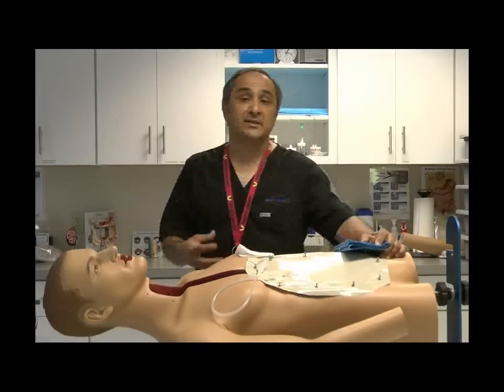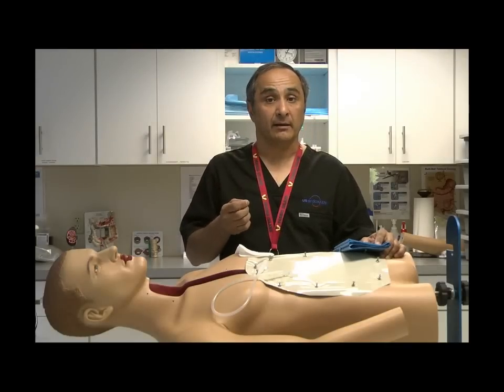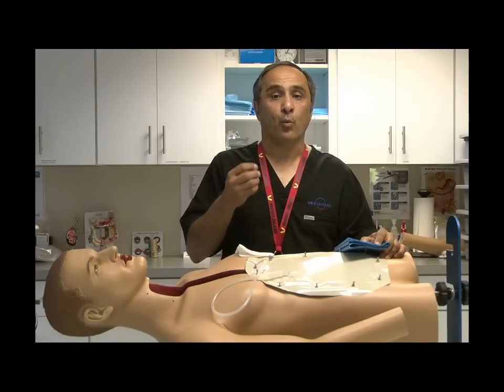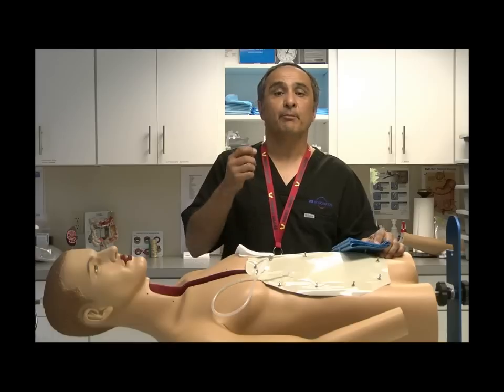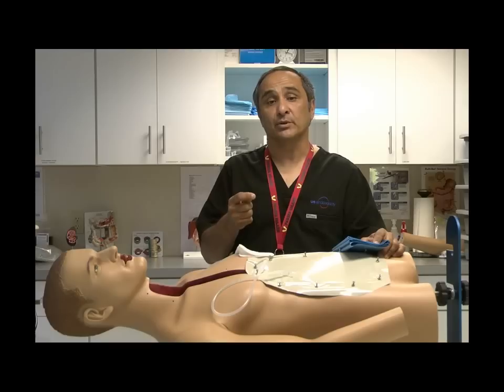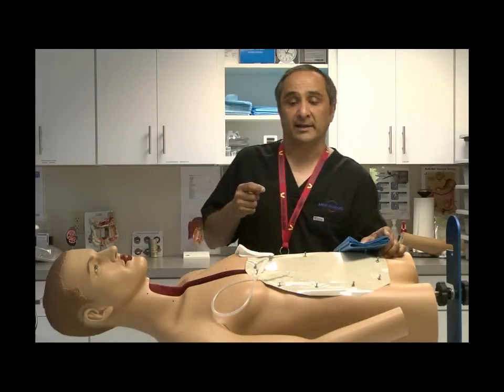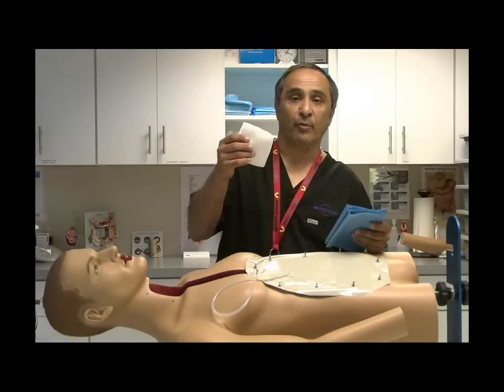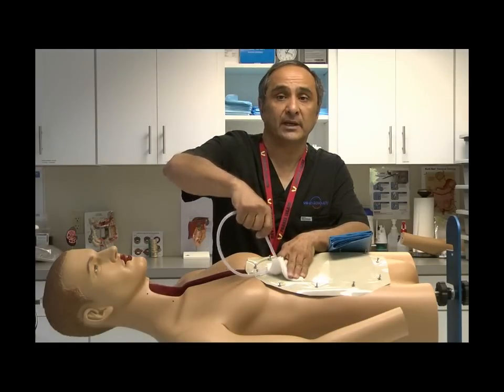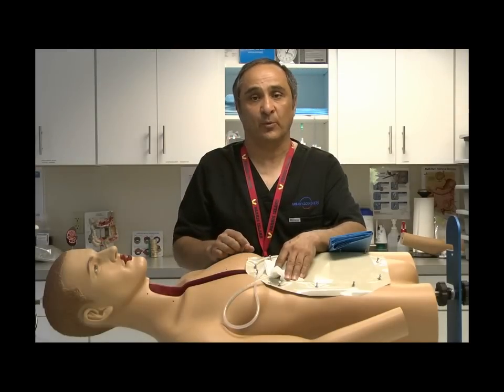At this time, I'm going to discuss the proper technique for removing the initial placement peg. But remember, this patient has to have a mature, well-established stomal peg tract prior to removal and prior to installation of the non-balloon peg device. Another important thing to keep in mind is be sure to have some sort of drape or 4x4s that can cover the peg site prior to traction removal. That'll just eliminate any biomaterials from contacting anyone in the room.